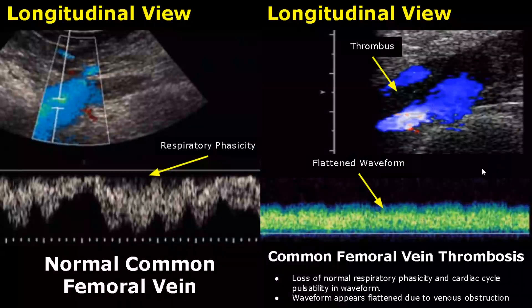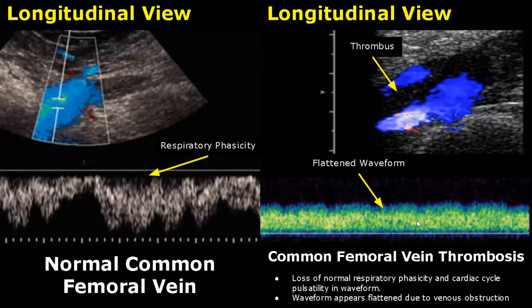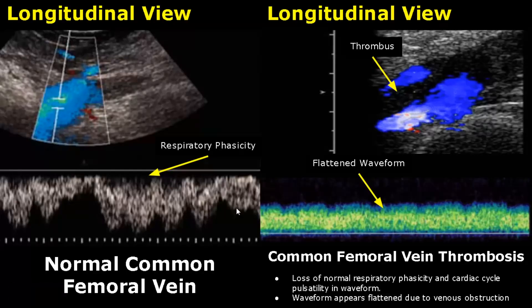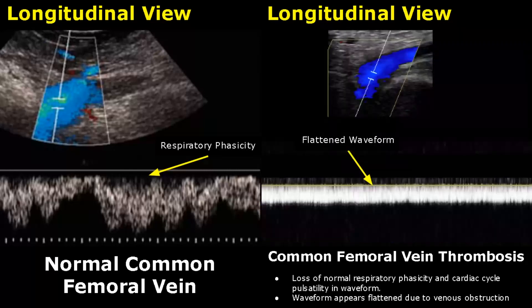The spectral Doppler waveform in cases of thrombosis will have a flattened presentation. There is loss of normal respiratory phasicity and cardiac cycle pulsatility, which is seen in the normal waveform of the common femoral vein. Here is another image showing a flattened waveform due to venous obstruction caused by deep vein thrombosis.